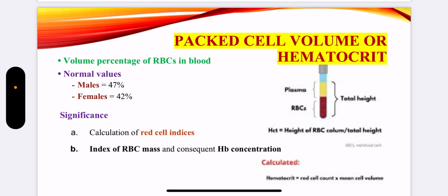Heparinized blood. Heparin is an anticoagulant. When it is added to the blood, and that heparinized blood is centrifuged in a test tube, there is separation of blood into several layers. RBCs tend to collect at the bottom, leaving the cell-free plasma at the top. We had discussed the same thing in our first lecture on the composition and functions of blood, that RBCs settle down at the bottom because of their higher specific gravity, and a layer of plasma is left at the top, and in between these two, there is a layer of buffy coat that includes WBCs and platelets.